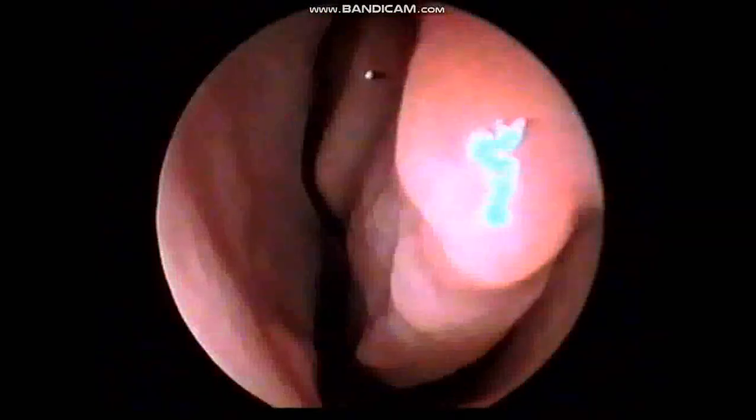You can see the deviation. It is an S-shaped deviation. Given on this side, the inferior turbinate is mulberry. So it's a case of deviated nasal septum with chronic rhinitis, and this patient has developed bilateral dacryocystitis. We are planning to do an endoscopic DCR together with the septoplasty.